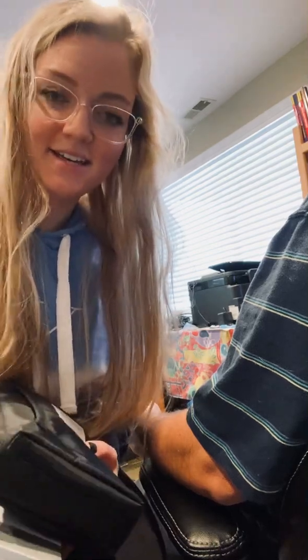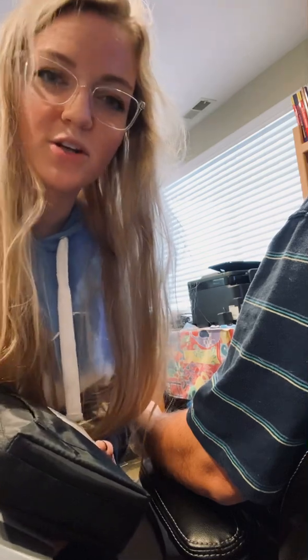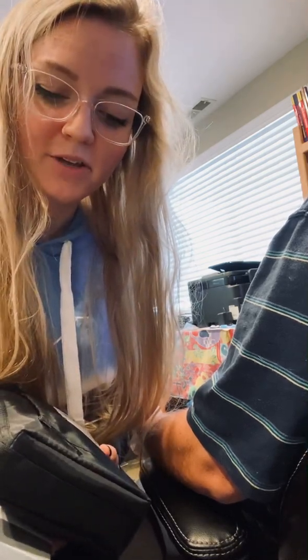Hey guys, it's Lexi. Welcome to my YouTube channel. Today I'm going to be showing you guys how to do a manual blood pressure.